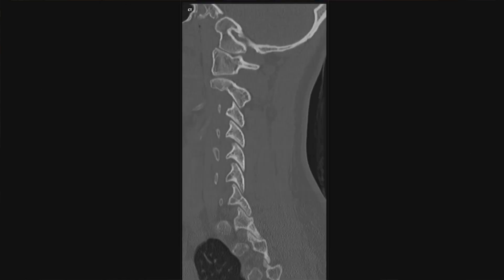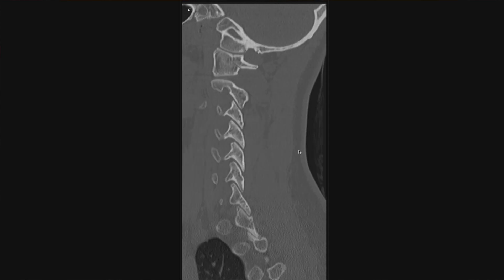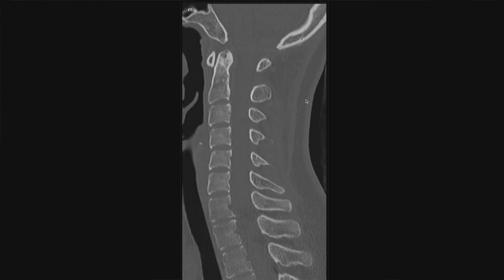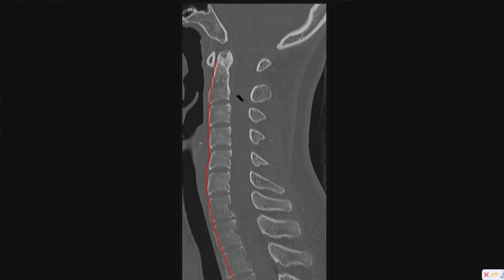The first thing I do is pull up the sagittal view of the cervical spine and get to a place where I feel like I'm cutting the vertebral bodies about in half, and the first thing I look at is alignment. There are a few different spinal lines that are important to look at. The first one is the anterior spinal line that runs along the anterior aspect of the vertebral bodies. I just want to see that all the vertebral bodies generally line up.